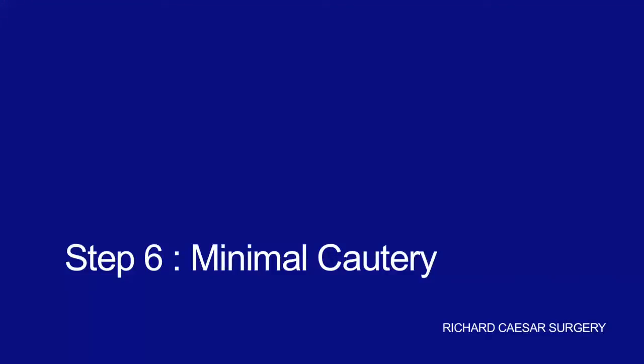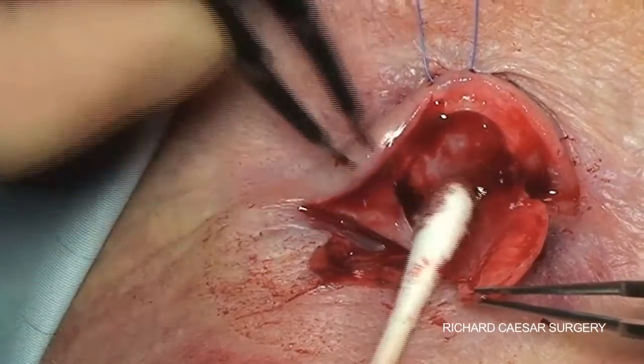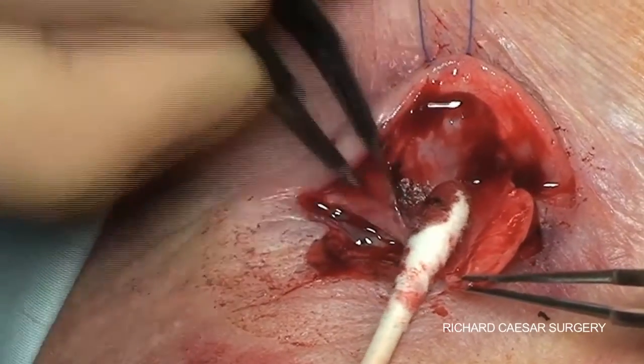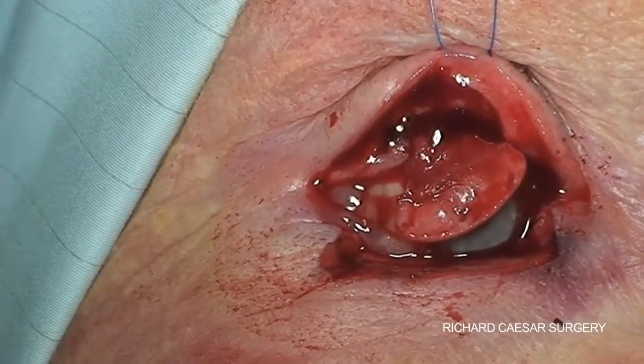Finally, use minimal cautery. You want your flap to be vascularised to bring in a blood supply.